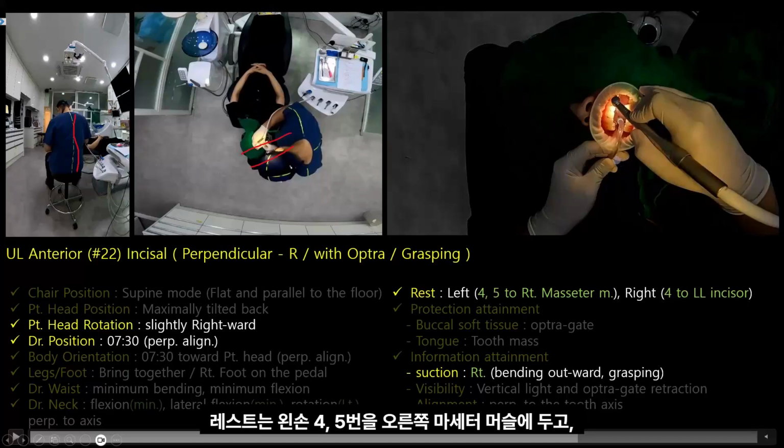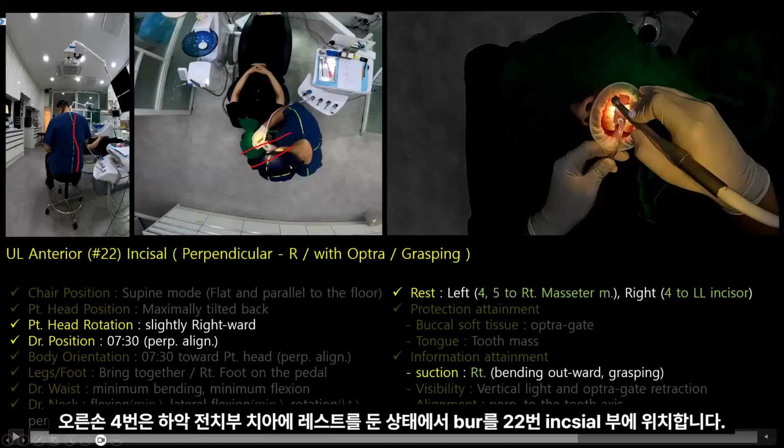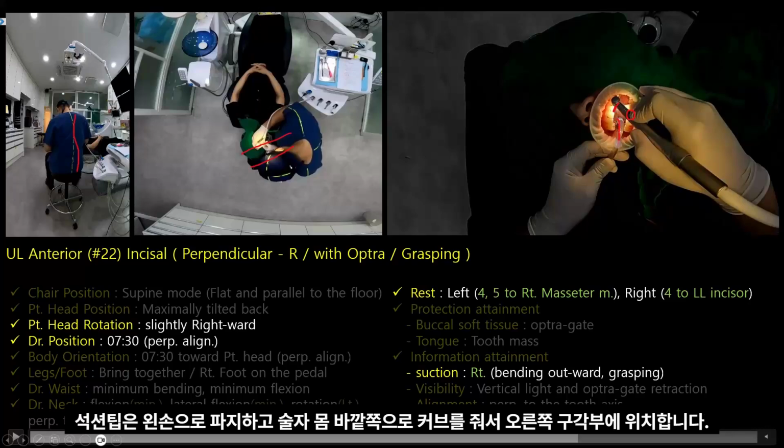For the rest, position the 4th and 5th digits of your left hand on the right masseter muscle, and the 4th digit of your right hand should rest on the anterior mandibular teeth. Then, place the burr on the incisor edge of tooth number 22. The suction tip should be gripped with your left hand, curved in an outward direction, away from the operator's body, and then precisely positioned at the right oral angle, facing this specific direction.